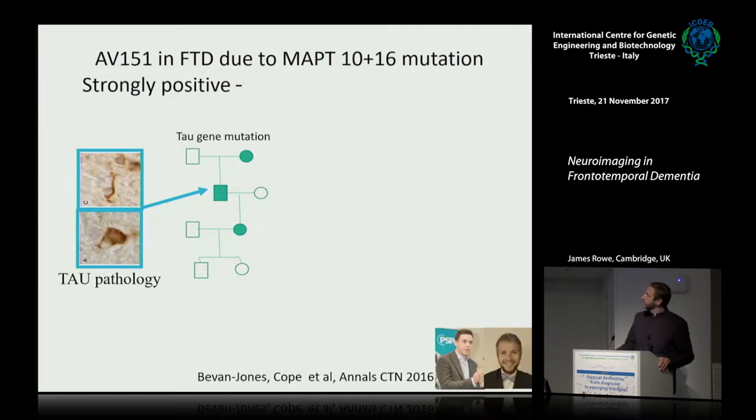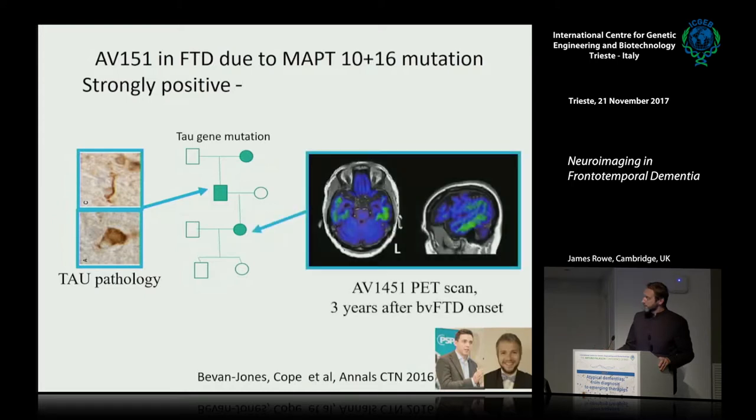He was actually in one of the cases in the 1998 Hutton series, identifying this mutation, and came into the brain bank in Cambridge. And his daughter had a PET scan with the AV1451 ligand showing very strong uptake in the light green here in the frontal and temporal lobes, 3 years into her florid bvFTD syndrome.